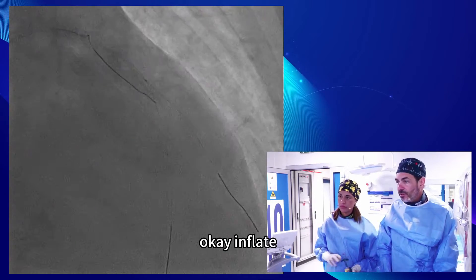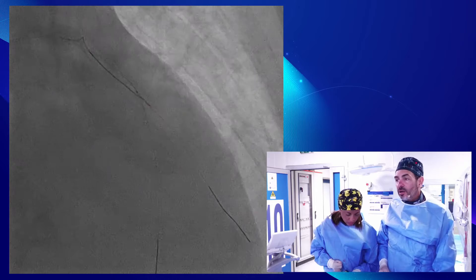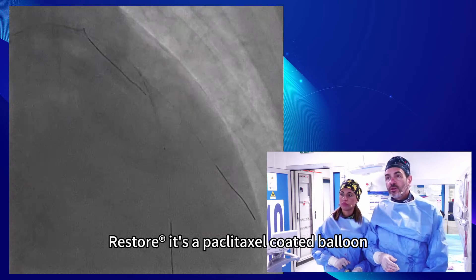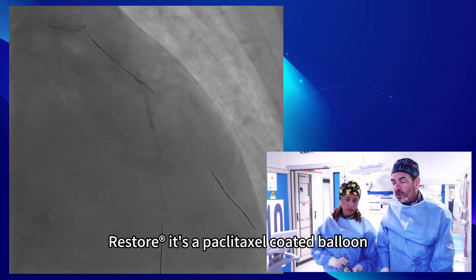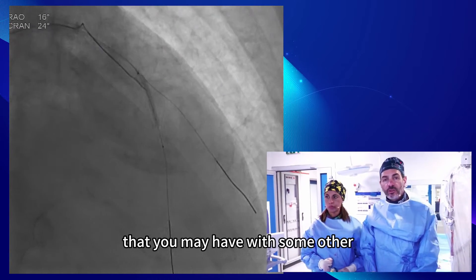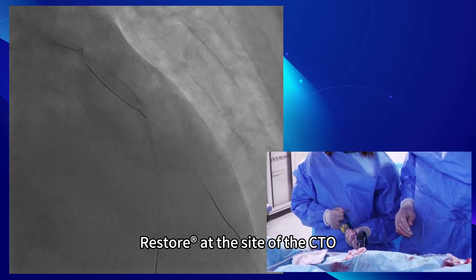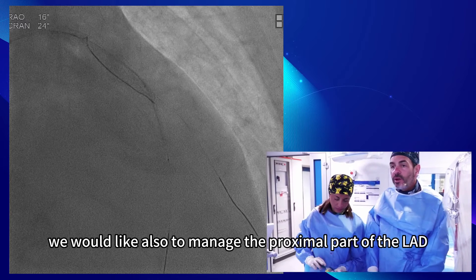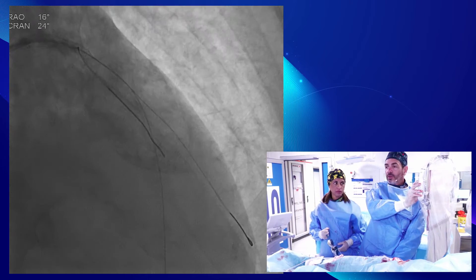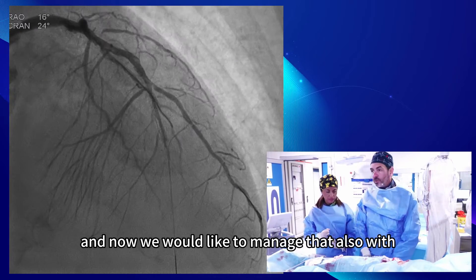Then we went again to manage the proximal and mid-LAD. We used a scoring balloon 3.25 in the proximal LAD to reopen it, because according to the OCT there was still a calcification and recoil to be managed. We reopened the CTO, which had again a recoil, and now we are using a drug-coated balloon. This is one of the latest generation drug-coated balloons — Restore — a paclitaxel-coated balloon with an amorphous formulation. Inflating at 12, then 14 atmospheres.